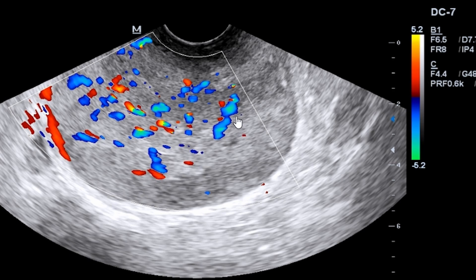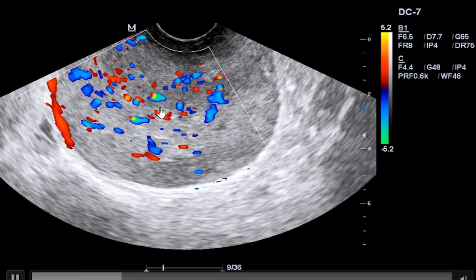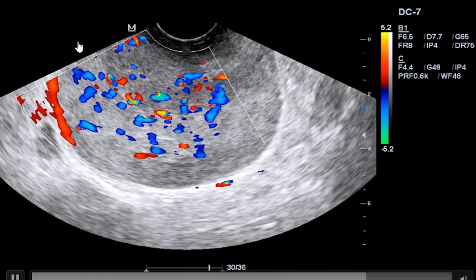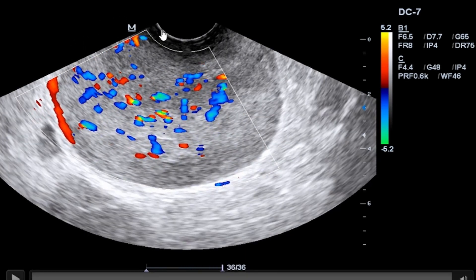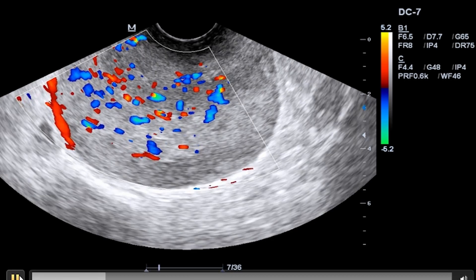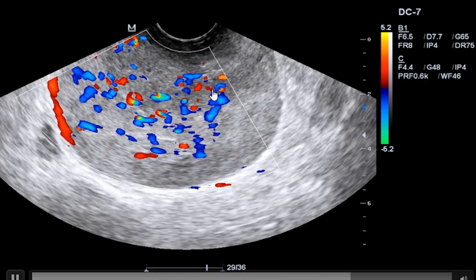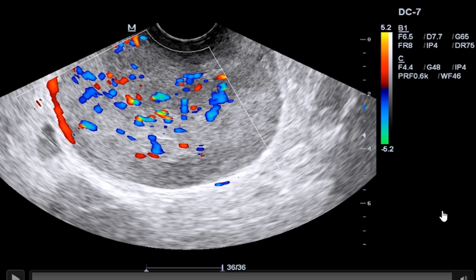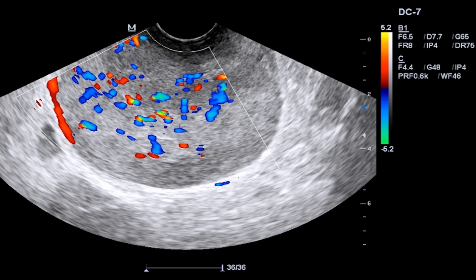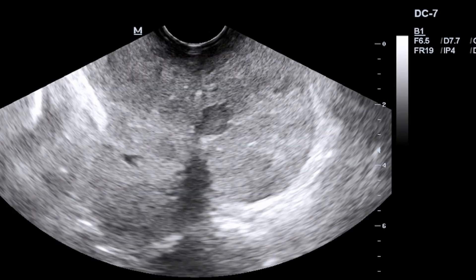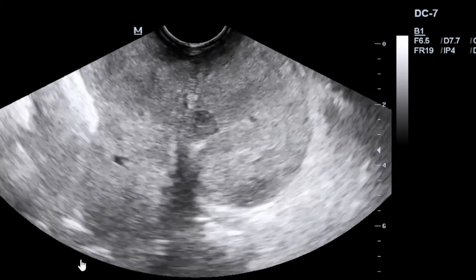As you can see in the same video, increasing the power gain or color gain, you can actually see that the perfusion is also getting more chaotic and more intense. This flow you are seeing here is typical of, or typifying, a malignant process or malignant transformation.